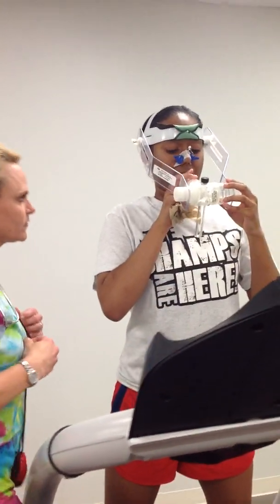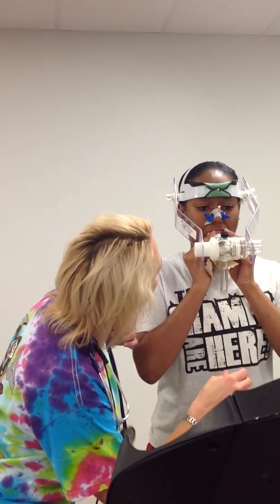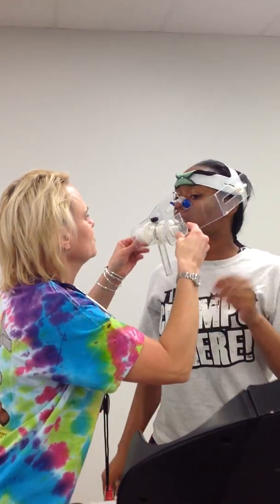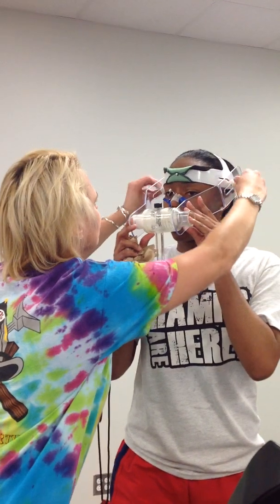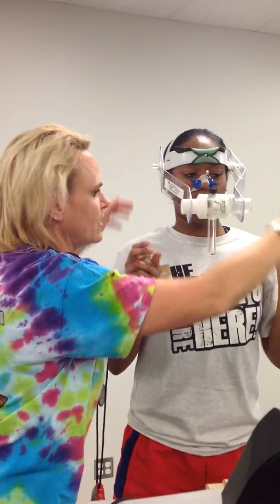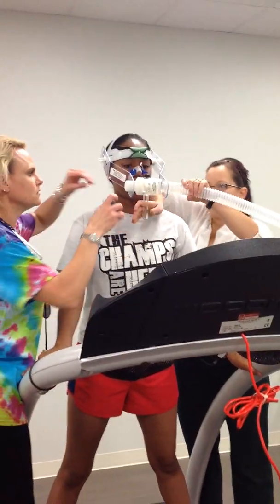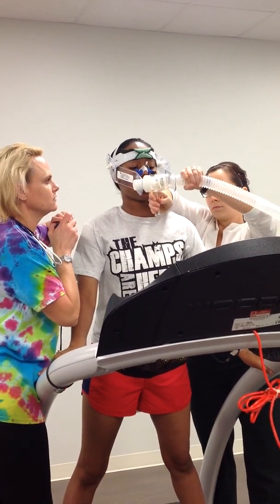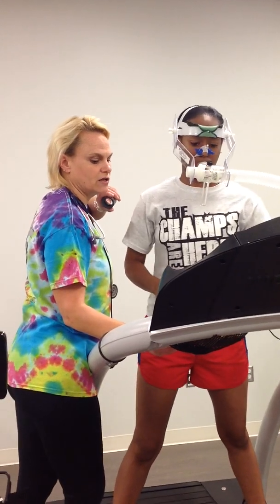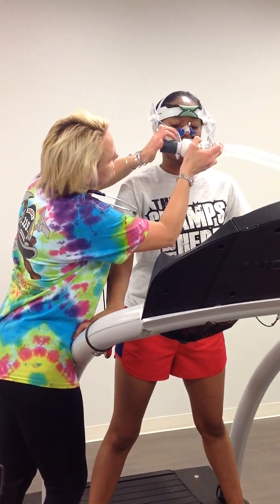Okay, go ahead and take that. All the way in. Can you turn towards me a little bit? There you go. Hold it up — there you go, good. Okay, release it. Is that okay? Could you help me and put this tube on?